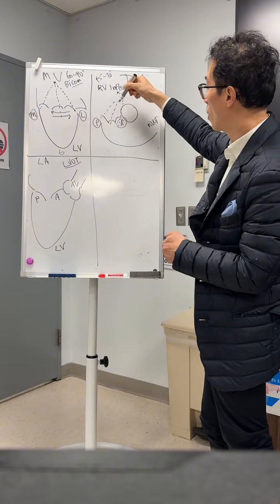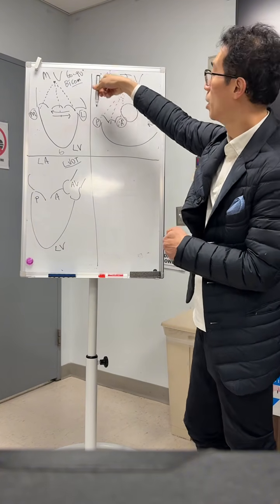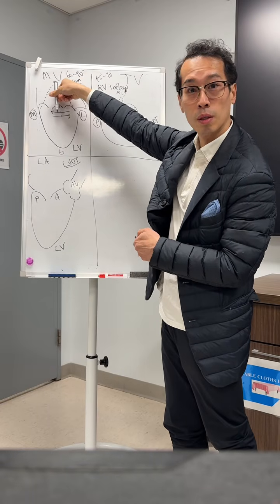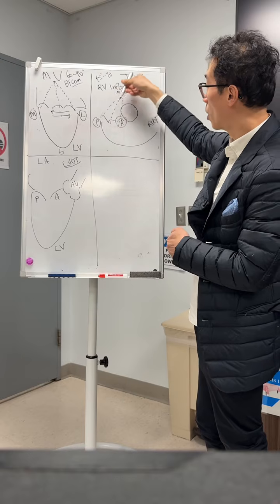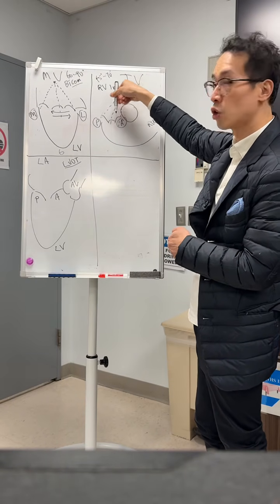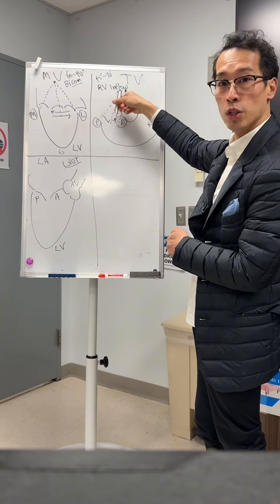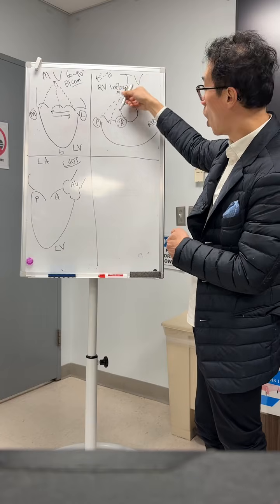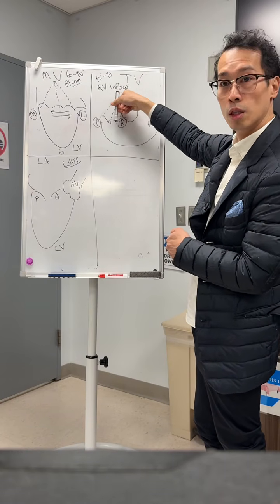Remember, the device has to be perpendicular to your annular plane, just like here. So if your device is here and your beam is oblique, what happens? You will only beam across a certain part of your clip, either the bottom portion or the higher portion. So you're not going to see the entire clip in terms of your orientation and also checking the grippers.